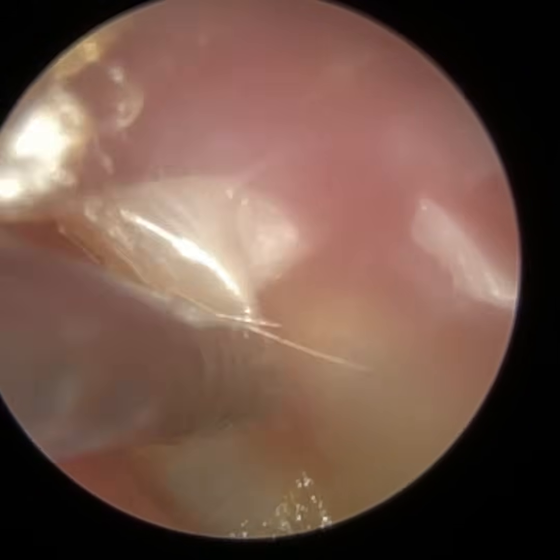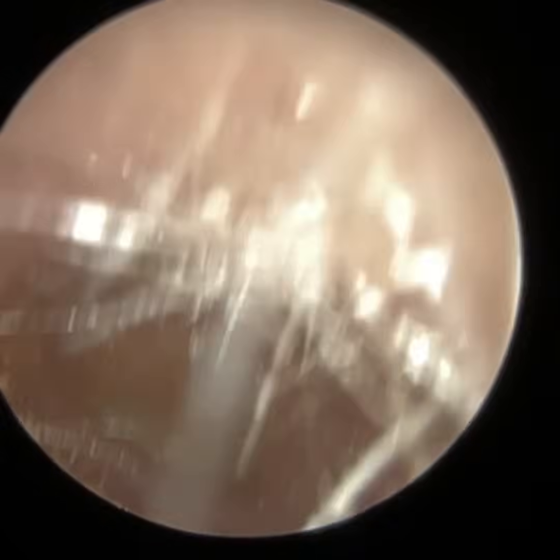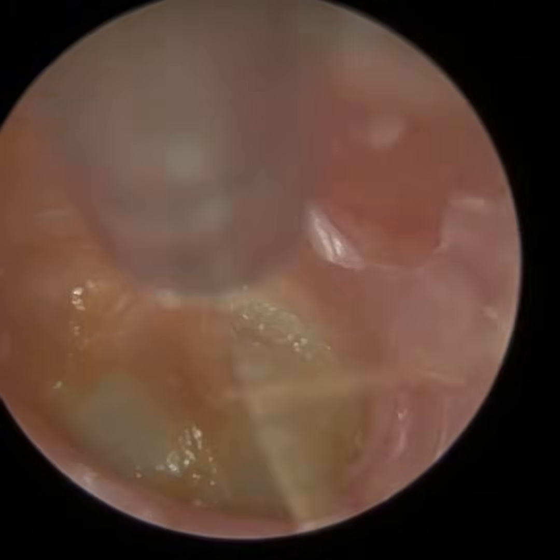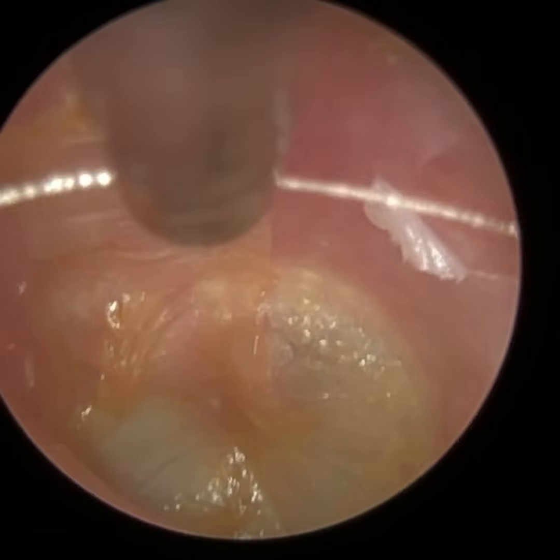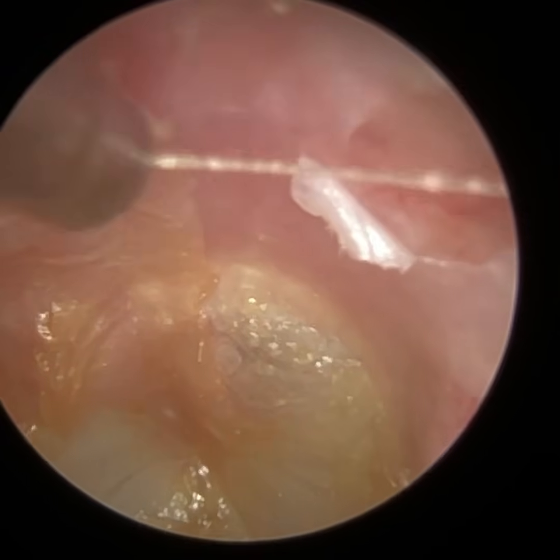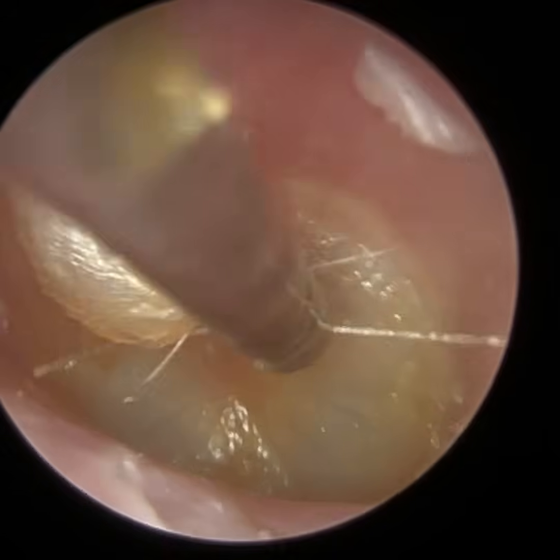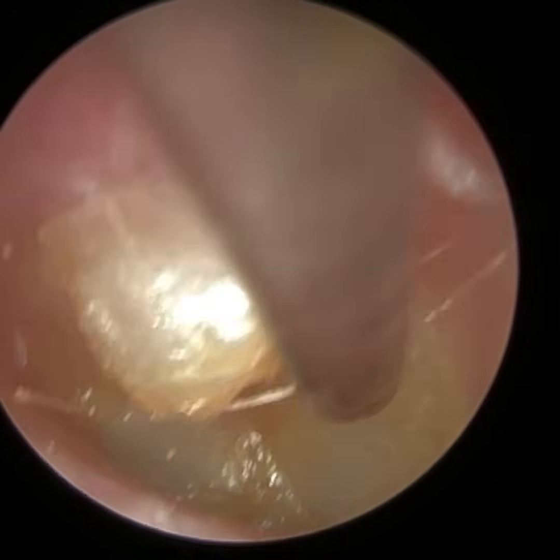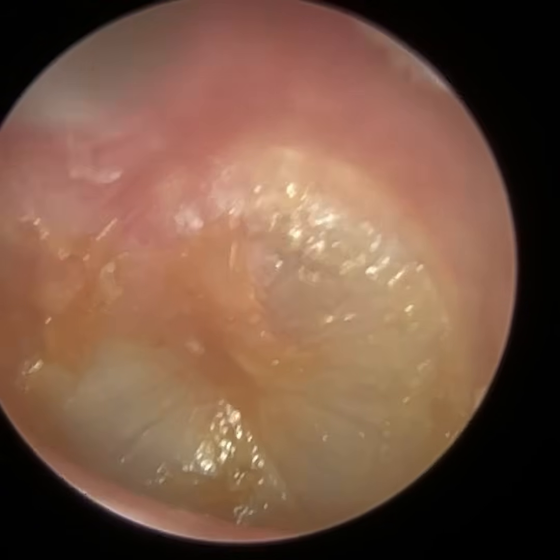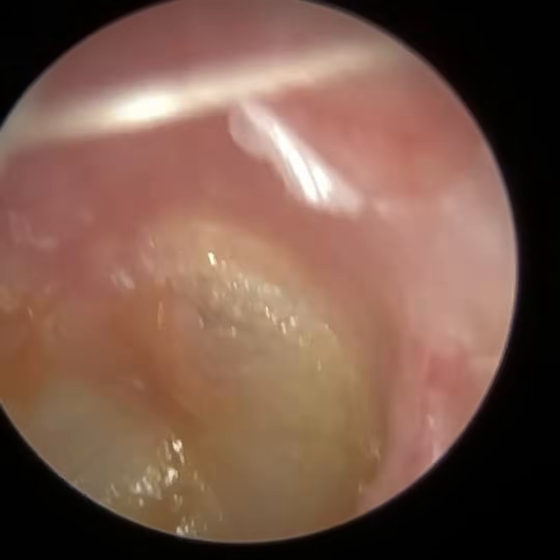So here, because we're working at the roof of the ear canal, I got off my ENT chair and I was almost on my knees looking up into the patient's ear to gain access. The patient had a bit of a stiff neck, so they weren't able to tilt their head. Sometimes you can ask the patient. So in the case of the left ear, I would ask the patient to tilt their head so the right ear is going towards their right shoulder. And that elevates their left ear, so I can view the superior aspect a bit better. But the patient wasn't able to do that because of a stiff neck. So I just crouched down, looked upwards.